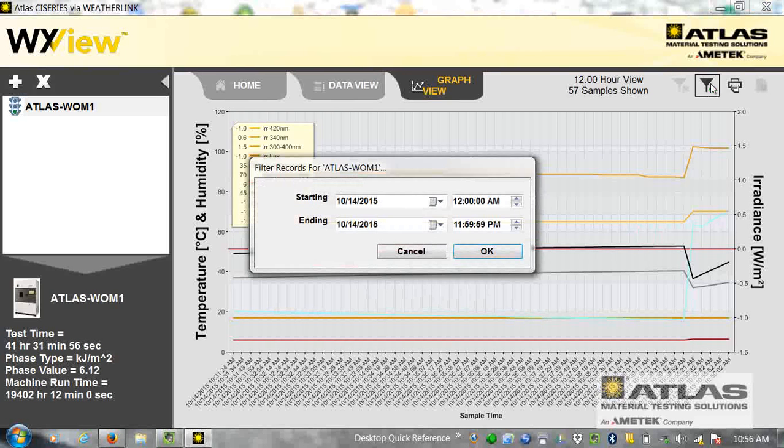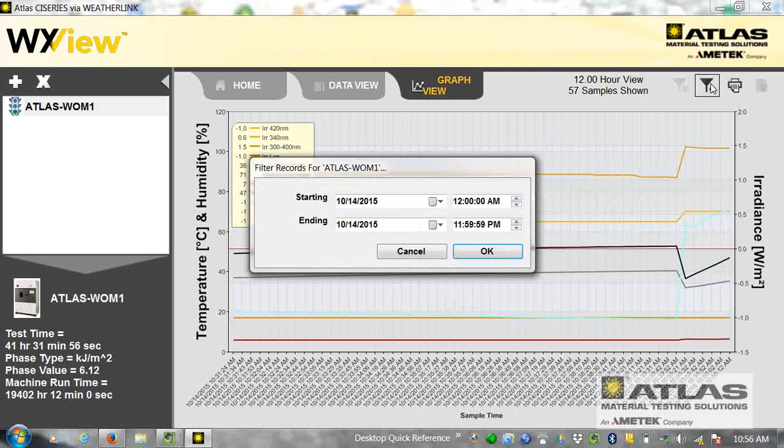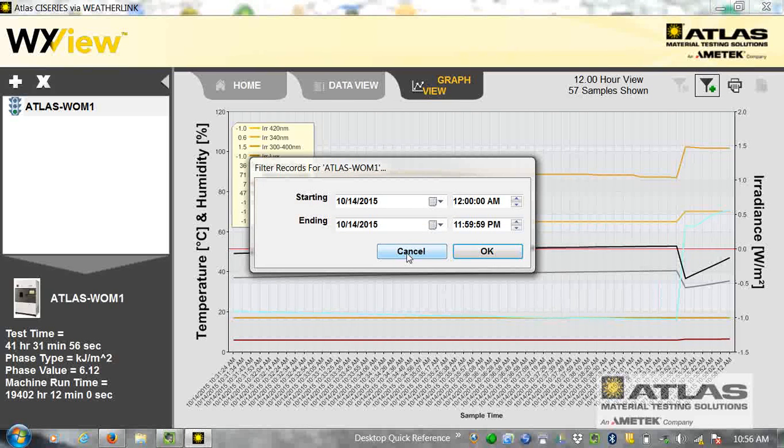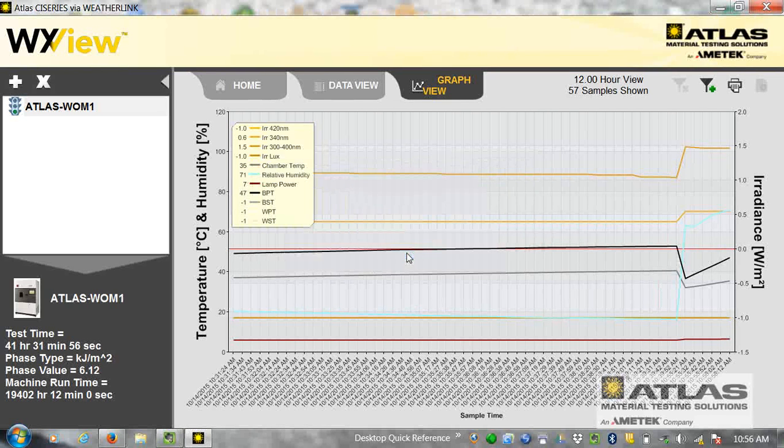If I go over to the right, I click this symbol here. I could zoom in starting and ending date to get a closer look at something.